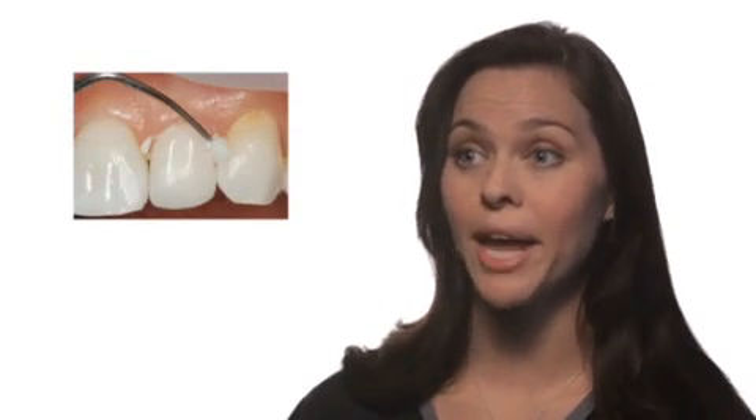I love Zone Free — it's made my job so much easier. There are a few features that I find beneficial with Zone Free. The first is the science behind the product. Zone Free is made with reflective nanofillers, so it has the potential to blend to any adjacent surface. This is especially desirable in an anterior case. I also really appreciate the auto mix dispensing system and the ease of cleanup and removal.